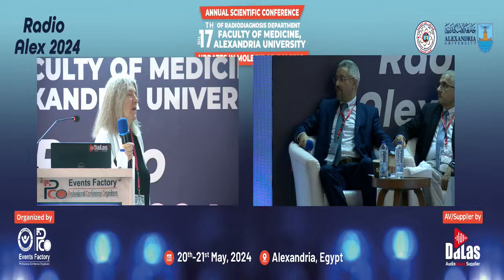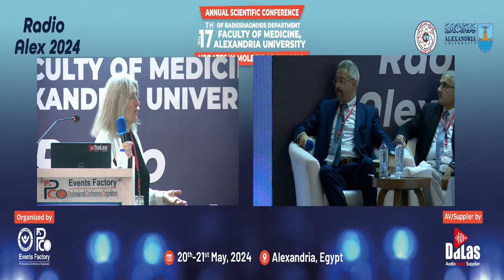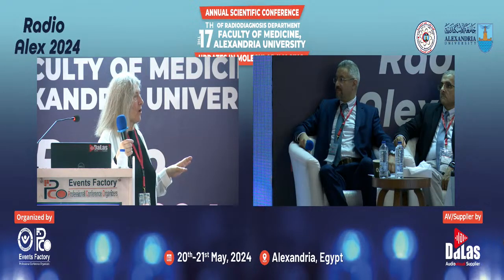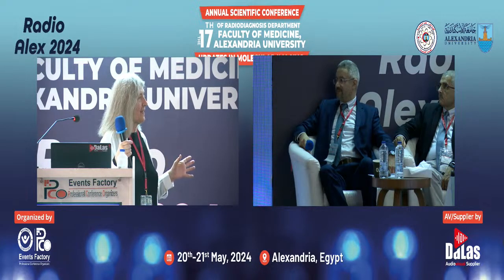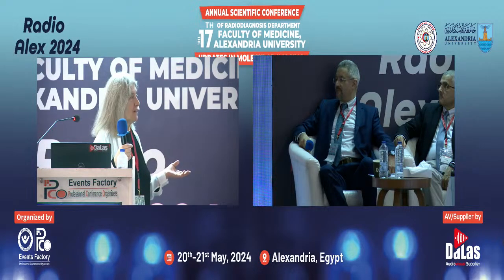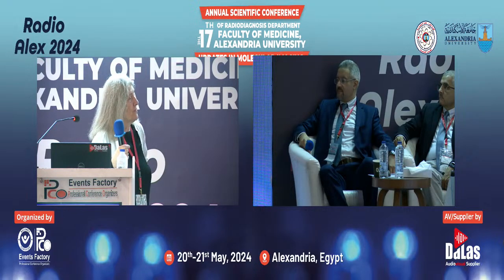And these are usually 1.5 T magnets. So if you think you're going to get a very high quality MRI with that scan, you're probably not going to get it. Not as high a quality, not as extensive a procedure. I'm not saying that PET MRI isn't useful, but in practicality, it's a great idea, but it has not reached widespread use yet. And in fact, whole body MRI for cancer staging and restaging has not really reached widespread use either, even though technically it could be done. So I don't know about that.